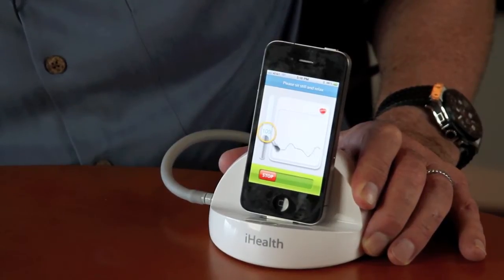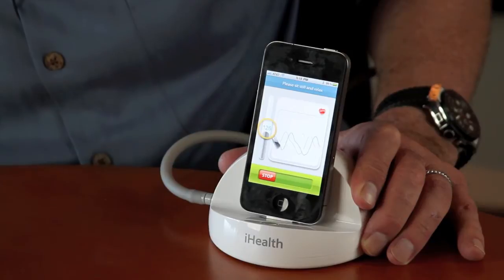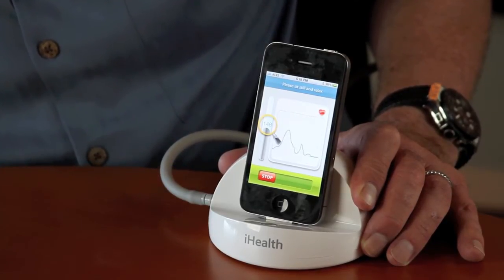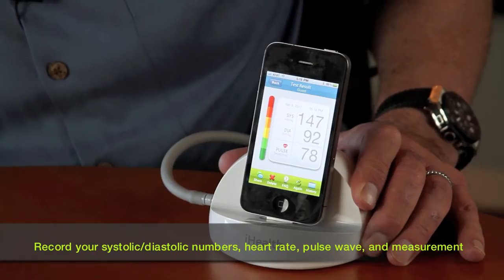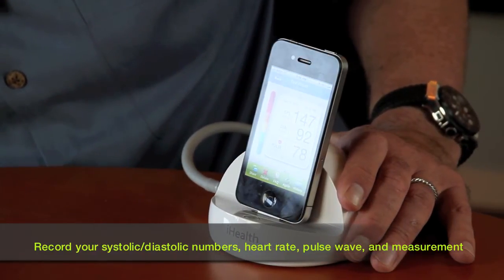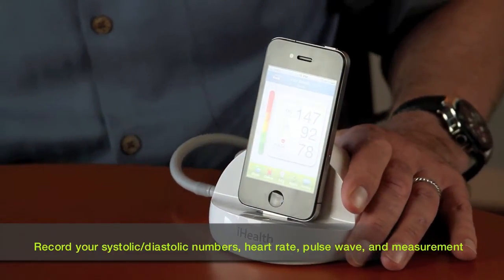It'll be finished in a moment. Okay, you ready? Watch this. There you go. Now it says 147 is the systolic, 92 is the lower reading, and 78 is my pulse. So there's my blood pressure.